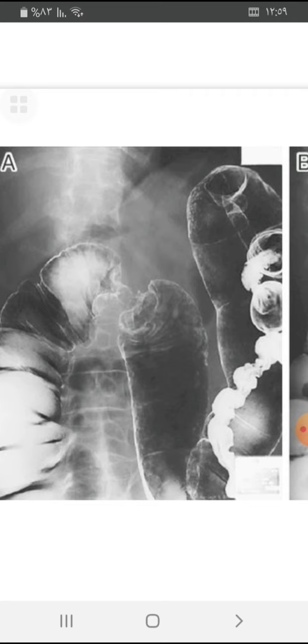The characteristic anatomy of the large bowel is the presence of haustra, which are thick, incomplete mucosal folds. Differentiate a large bowel loop from a small bowel loop, which has the valvulae conniventes, which are thin, complete mucosal folds. For barium enema, the patient should be prepared. This preparation is called 3 days preparation. It resembles the colonic preparation prior to surgery, but it does not require the use of medication. Not required use of antibiotic.